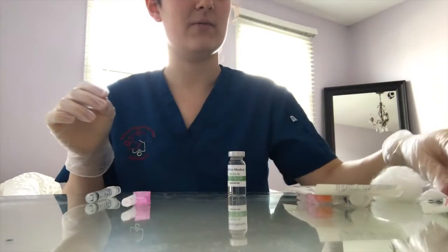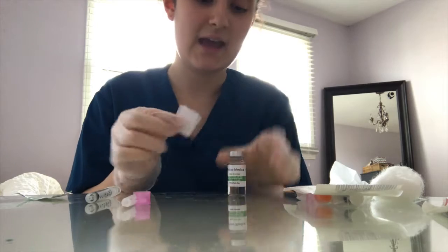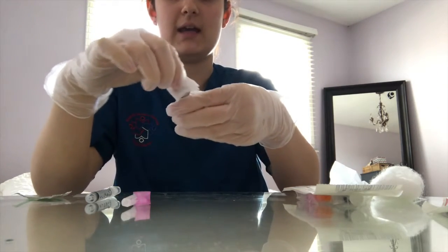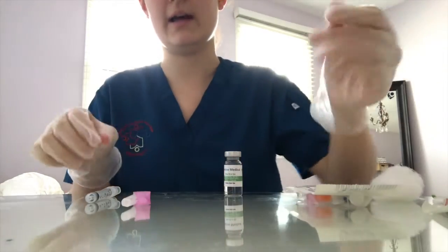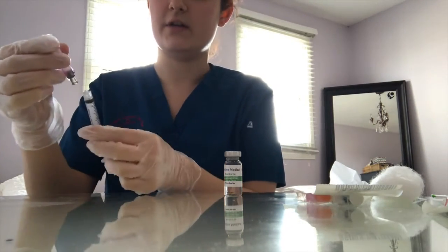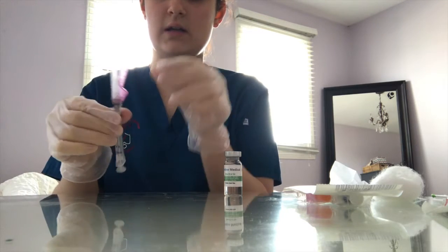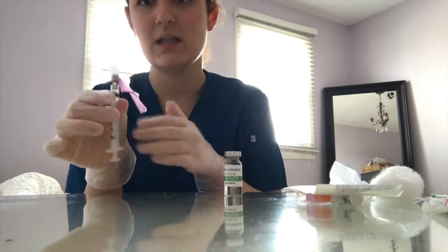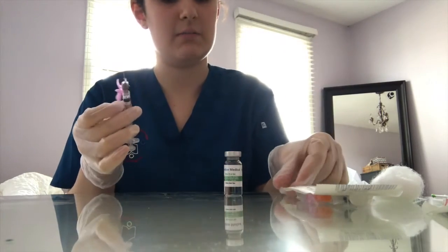And what would I do? I would open an alcohol swab and wipe the top of the vial because I want to make sure I get off any lingering bacteria. I'm going to let that dry while I assemble my actual needle. This has a safety hub on it, so you just put it on and twist it till it feels secure, and you pull back the luer lock. It's a safety precaution on needles.